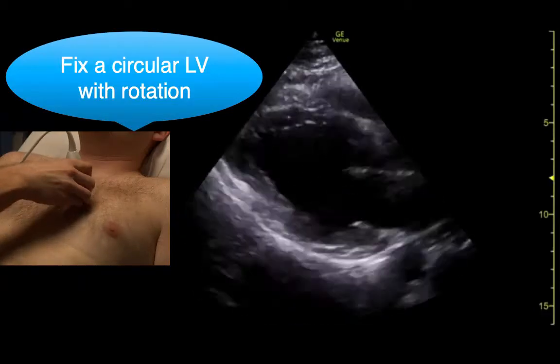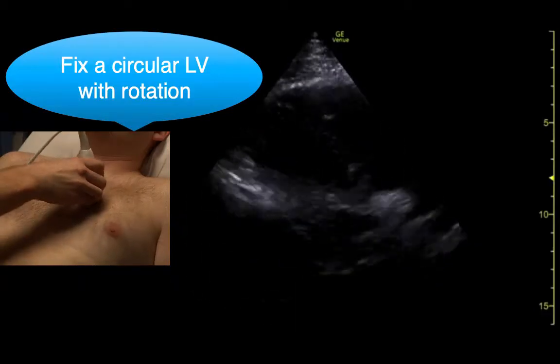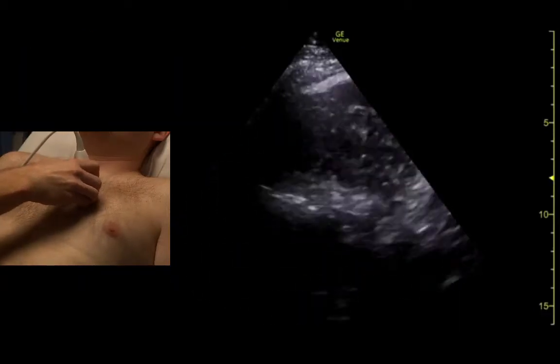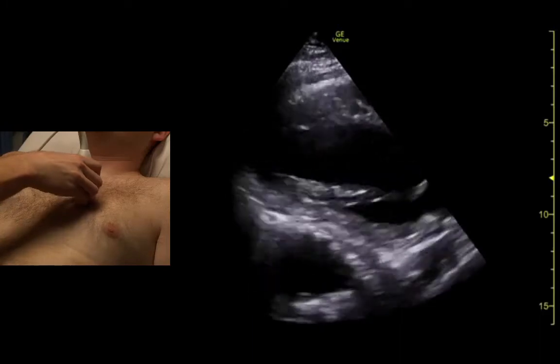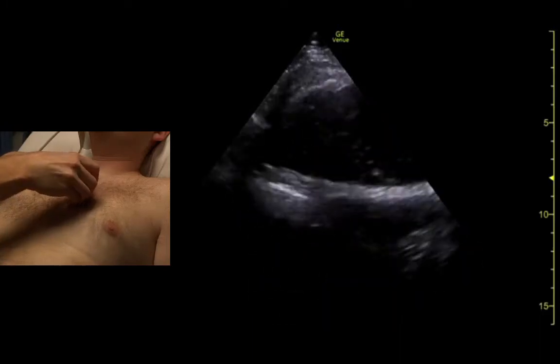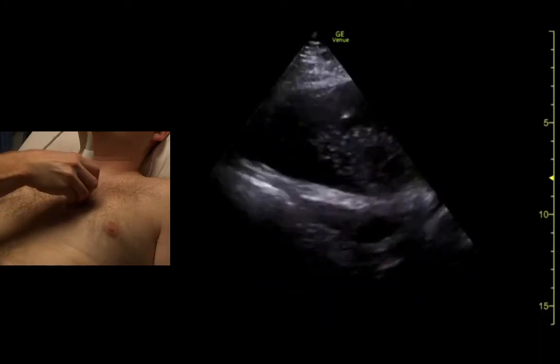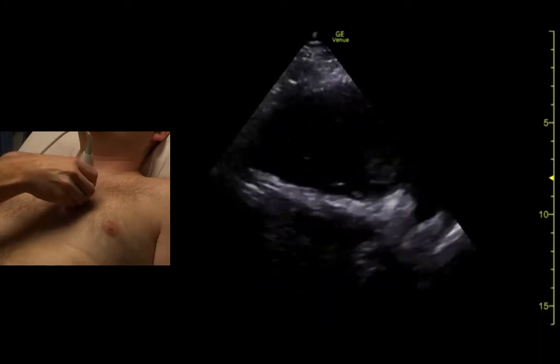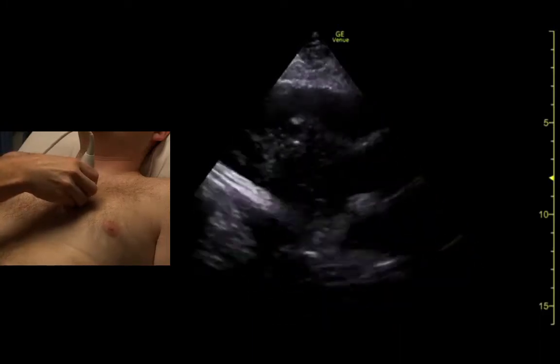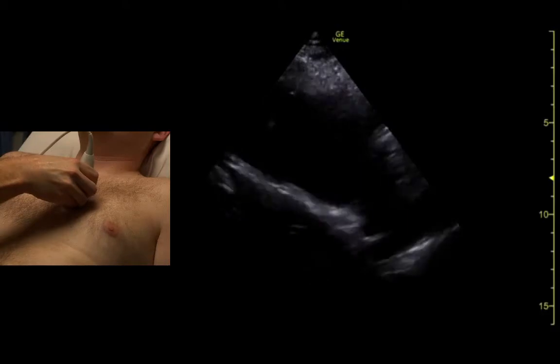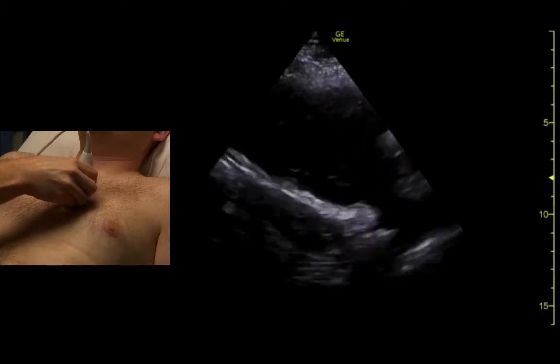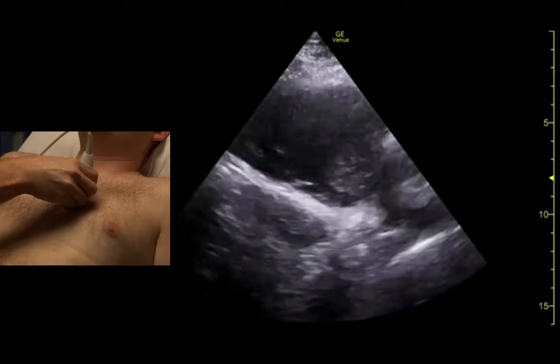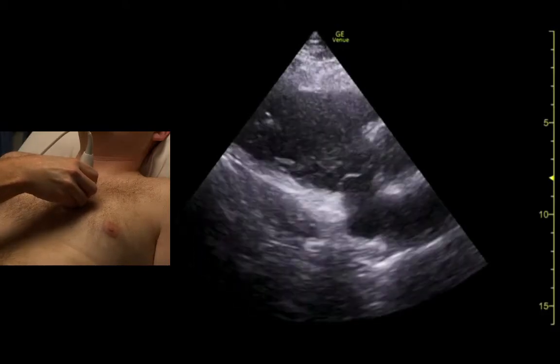The other mistake is sometimes you see this where that's all right ventricle. It means we're in too far, pushed down too far toward the feet.